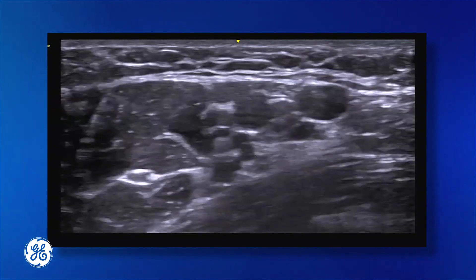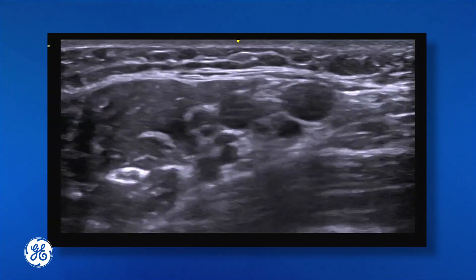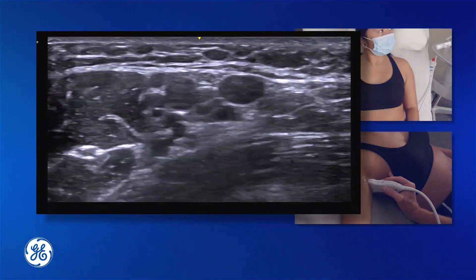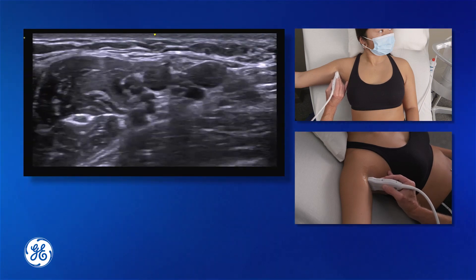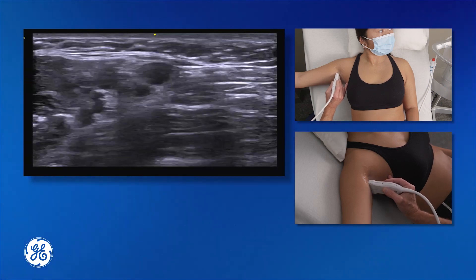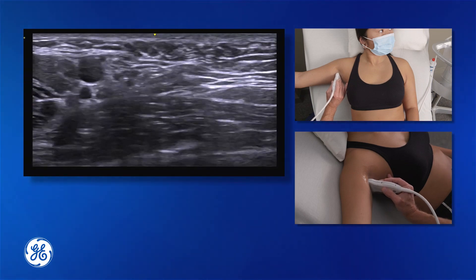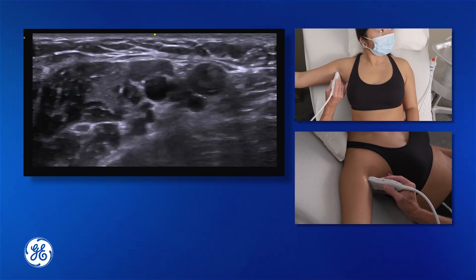There's another nerve that we can see on this screen as well, which is the medial cutaneous nerve of the forearm — a very small structure sat between the artery and the vein. You can also block that; it's a sensory nerve to the medial compartment of the forearm. There are two other nerves we will try to target in the axillary brachial plexus block: the intercostal brachial and the medial cutaneous nerve of the arm, which cover the area of skin just above the cubital tunnel. To block these, we apply local anaesthetic medial to the plexus and into the fascial plane between subcutaneous tissue and muscle, which should give some coverage for those two nerves.